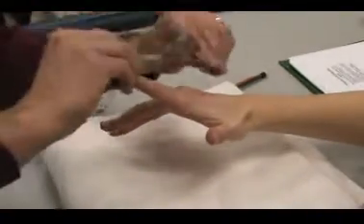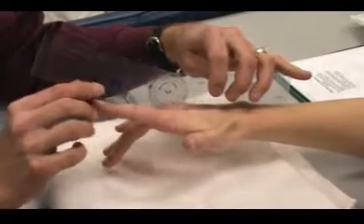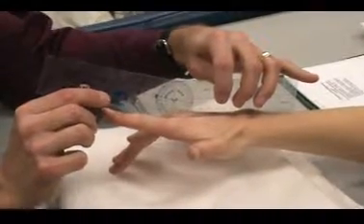If we look at extension — remember we can't measure it with the short goniometer, it doesn't go that far. So if we're really interested in the extension, we'll use the longer one. And she's got about 12 degrees of extension.